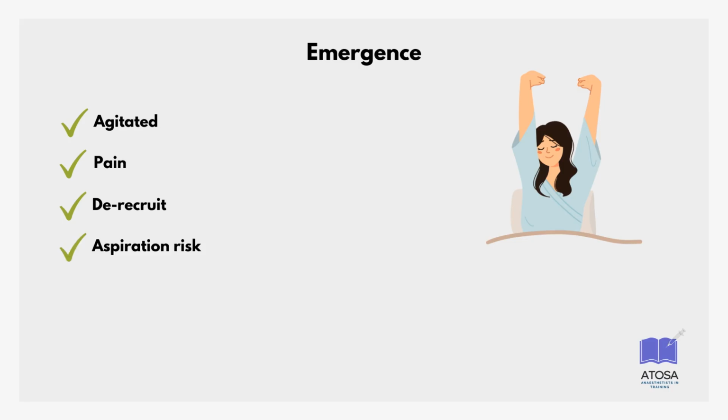The aspiration risk still exists. Consider the use of a bite block between the molars and always ensure adequate muscle relaxant reversal prior to extubation. Finally, if the intubation was difficult, take extra care at extubation. It's not an airway that you want to tackle twice. These are patients to be patient with. Take your time and only extubate when you are certain that the patient is capable of maintaining their own airway, so you don't have to.